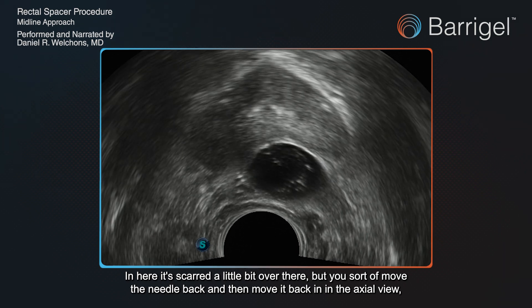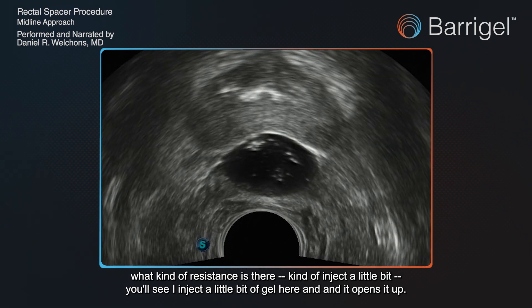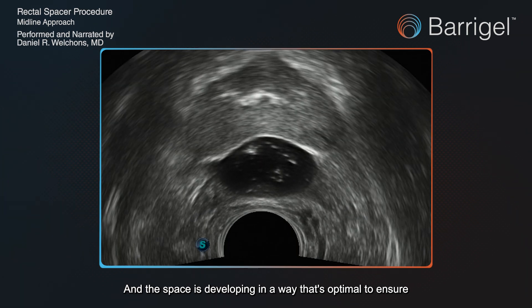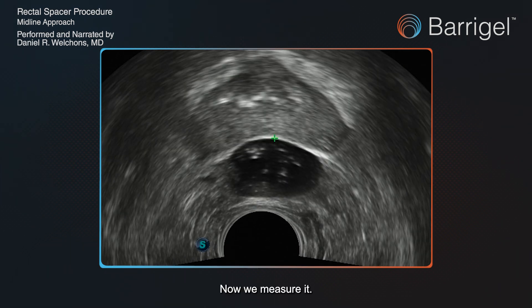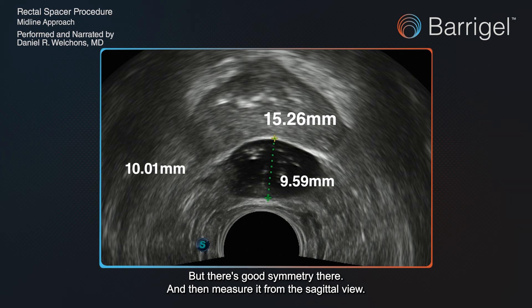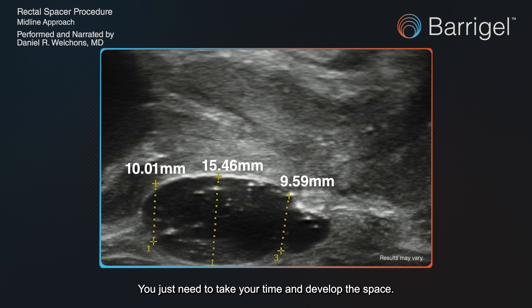It's a bit scarred over there, so you move the needle back and then advance it again in the axial view in small steps — little baby steps — moving over and feeling what kind of resistance there is. I inject a little bit of gel and you can see it opening up more and more. The space is developing in a way that's optimal to ensure decreased toxicity from the radiation therapy the patient is going to receive. Now I measure it — I tend to measure it just to see. That's 15 millimeters. It's not totally necessary to get that much space, but there's good symmetry. I also measure in the sagittal view and can discuss with the radiation oncologist what kind of space we're getting, which can be very helpful. The procedure is easy to control — you know where you're going the entire time. You just need to take your time and develop the space.